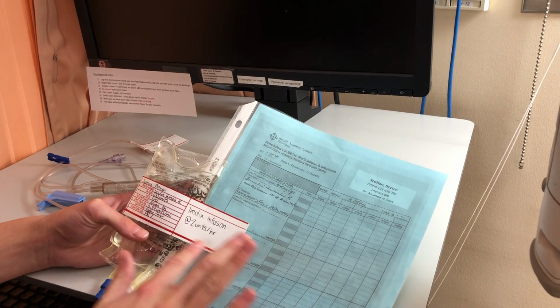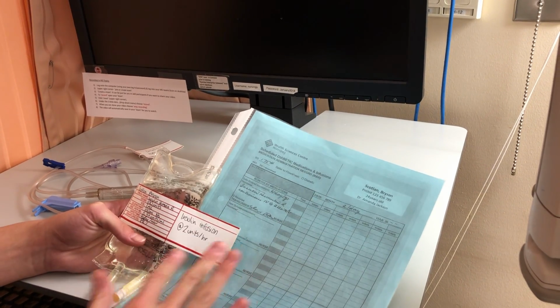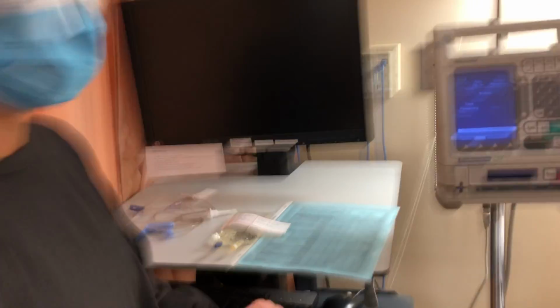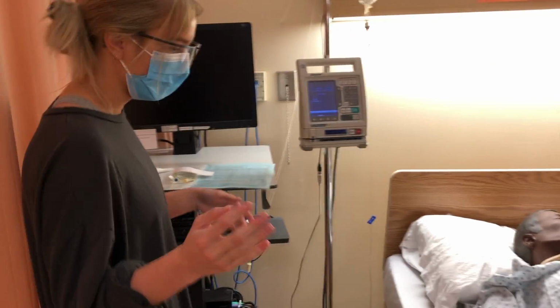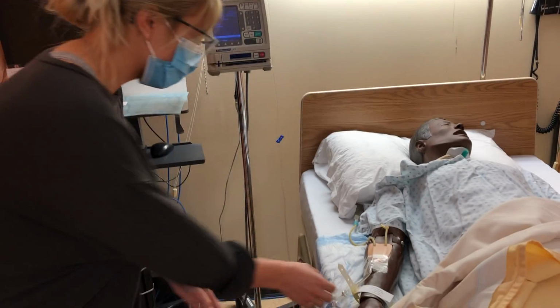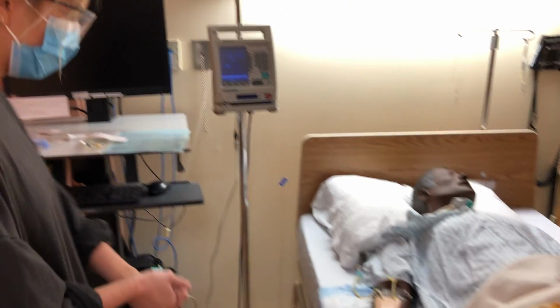And it's been signed, and we have our infusion running there. So I've done my third check. I've told the patient what they need to know about. I'm making note of the normal saline bag that's running TKO. So everything looks good. The IV site looks good.